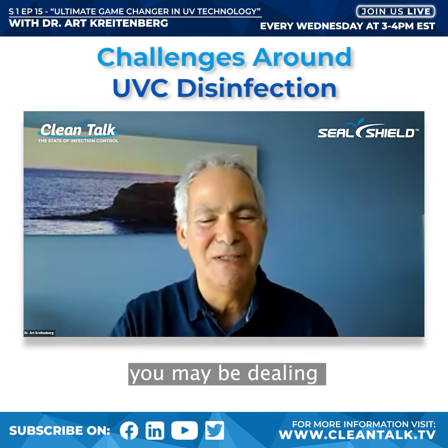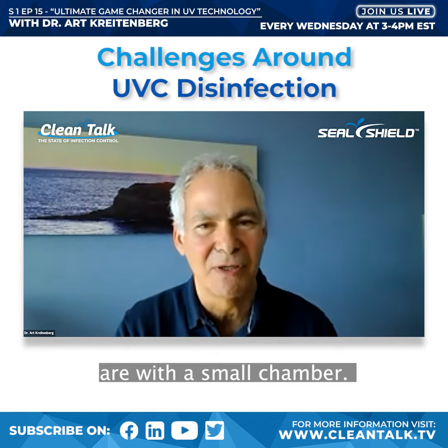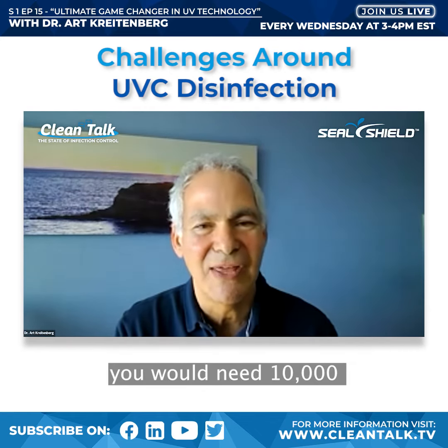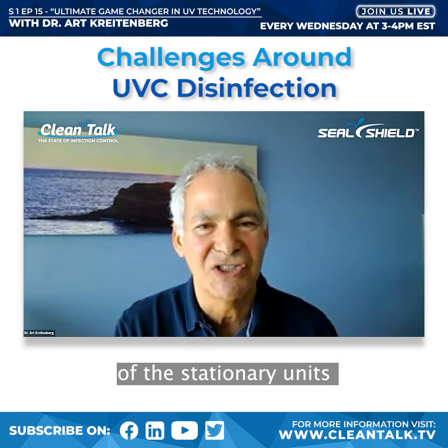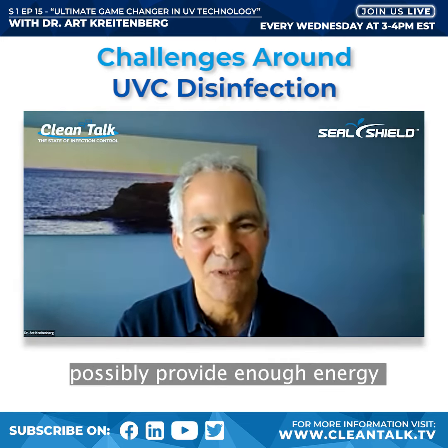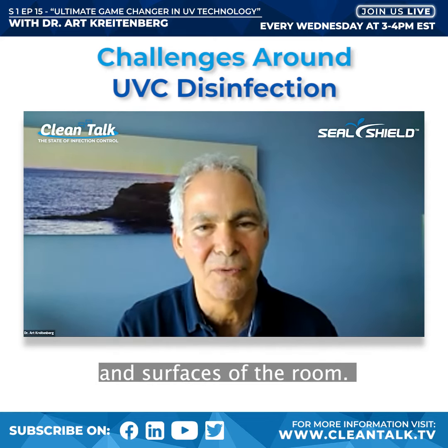Now, you may be dealing with 10,000 times the volume that you are with a small chamber. So theoretically, you would need 10,000 times as much energy. And that's the failure of the stationary units, is that they can't possibly provide enough energy to effectively disinfect the contents and surfaces of the room.